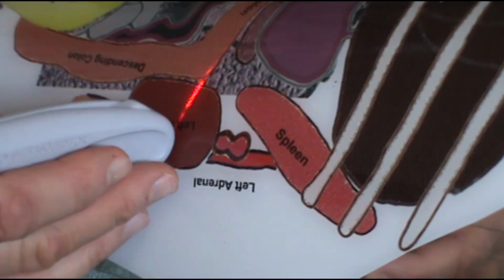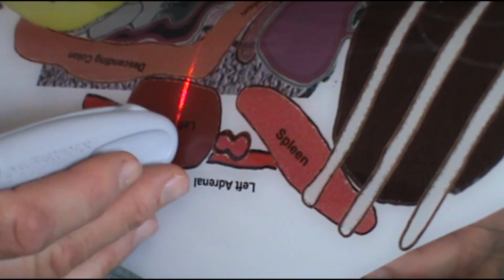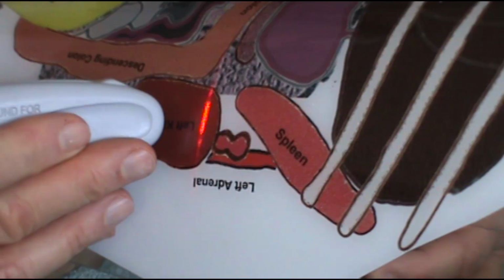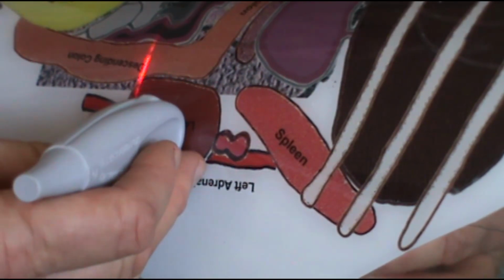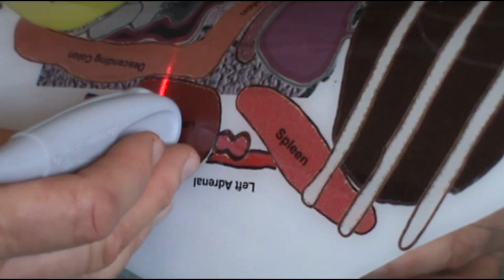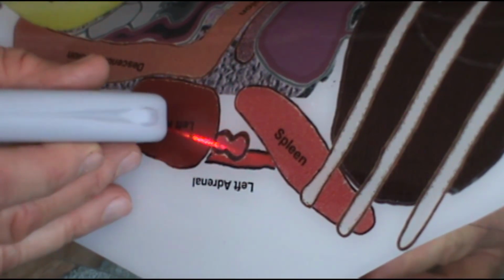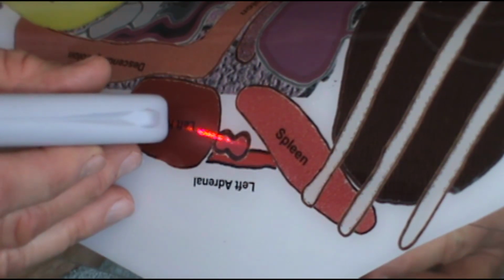Rotate the transducer 90 degrees counterclockwise to a transverse position. Fan cranially, then caudally, until all kidney tissue has been seen. Rotate the transducer 90 degrees clockwise back to a left lateral sagittal position over the left kidney.